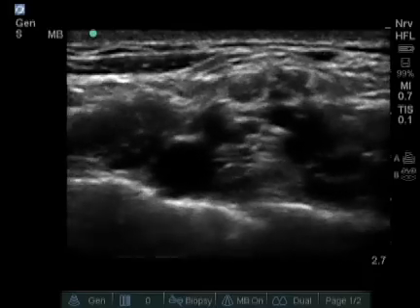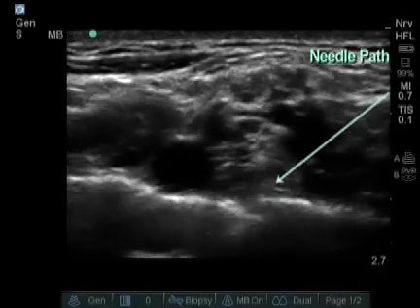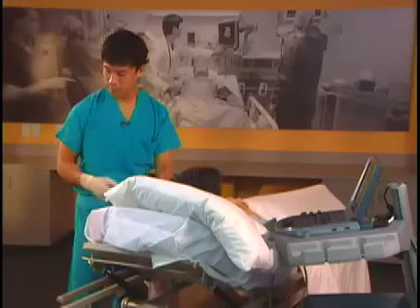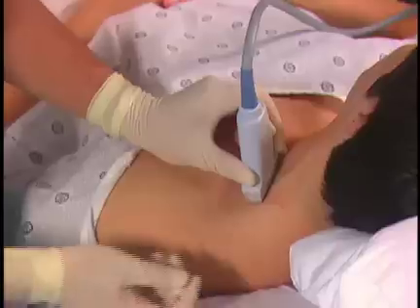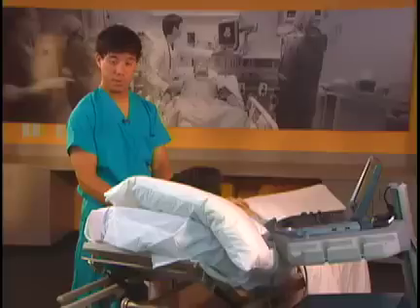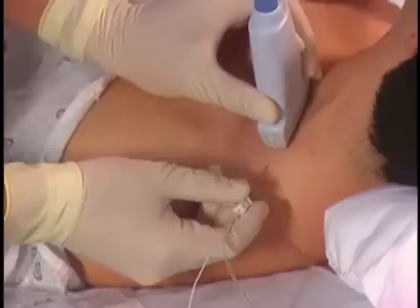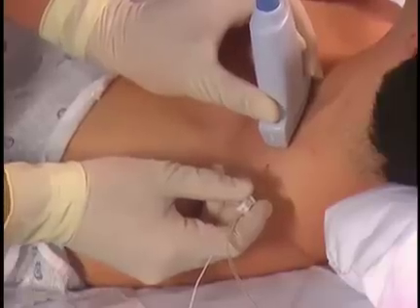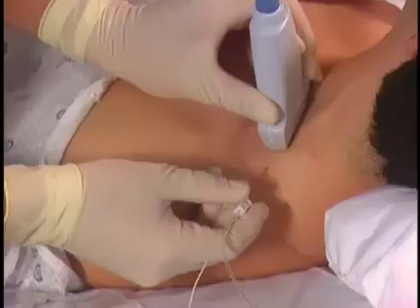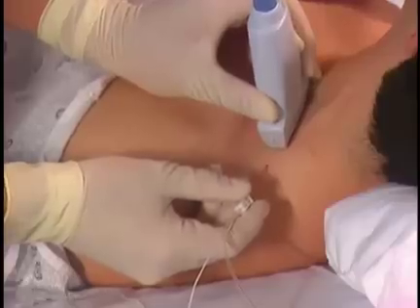Usually I do two injections for the supraclavicular block. I put one injection down in the corner between the pulsating artery and the first rib, and then I put a second injection up higher by the superior trunk. My needle position for the supraclavicular block comes posterior to anterior and starts about a centimeter away from the probe. If I start a centimeter or more away from the probe, my needle angle will be flat and it will be visualized better on the ultrasound machine. It's very important to have my needle completely in plane with the ultrasound probe so it will be visualized during its entire length. Give some injection of local anesthetic, usually about one to two milliliters, to see the spread of the local anesthetic on the ultrasound screen.